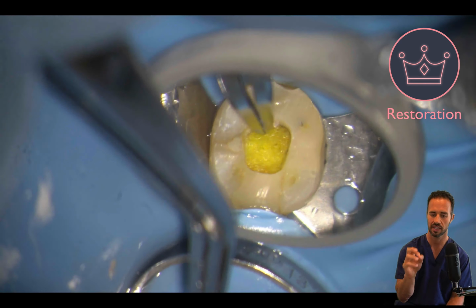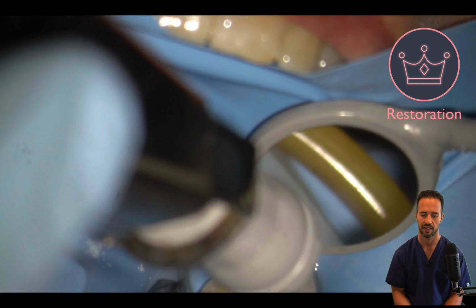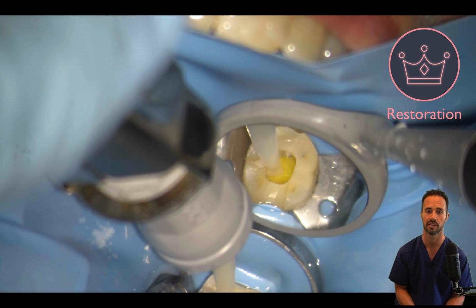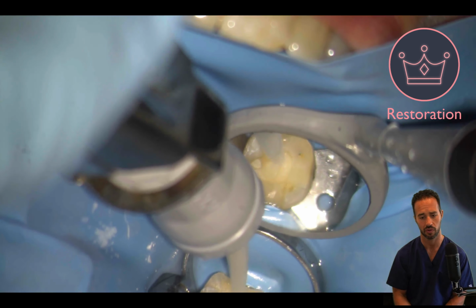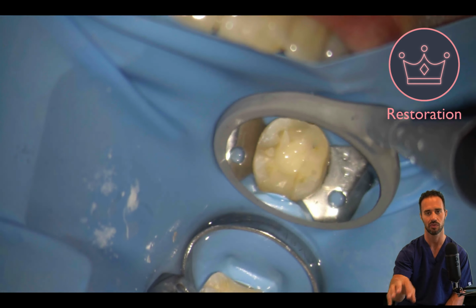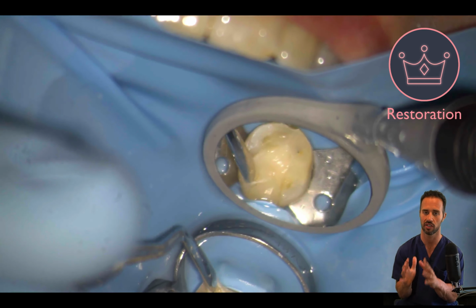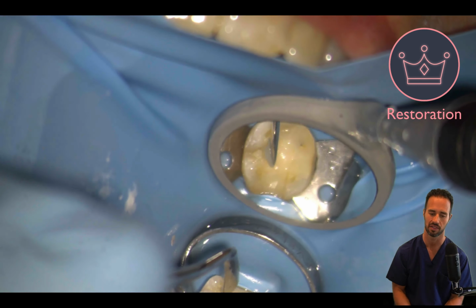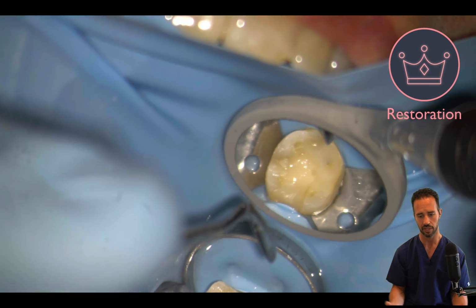And I'm placing the sterile sponge. In this case, it's a yellow color, like I mentioned. And then my Fuji 9, my temporary restoration, okay? So again, if you want to go ahead and place your core buildup, be my guest. This is such an easy case to do your core buildup. I would probably, no question, do it right here as opposed to doing a temporary and reappointing the patient. But there you have it.